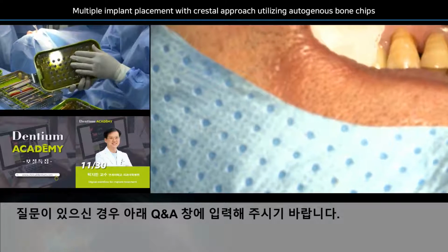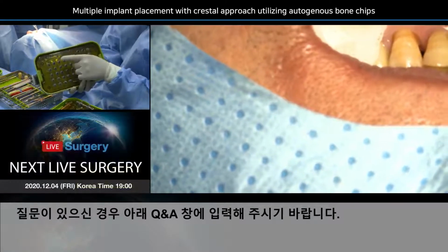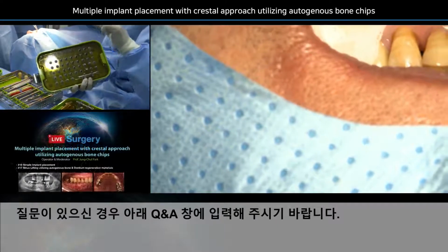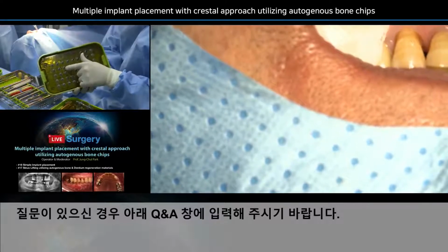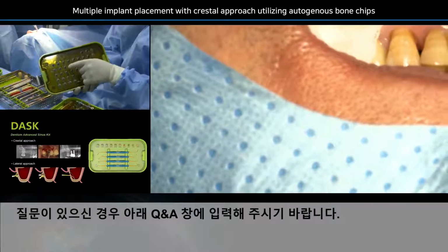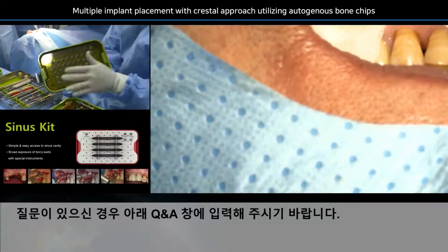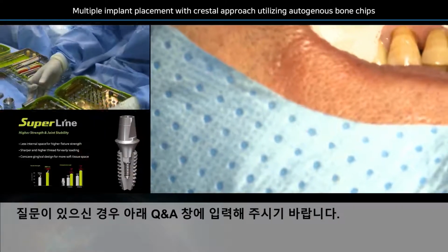If you are still an experienced surgeon, you can still use the stopper. If you choose the 10 millimeter, you can use the 8 millimeter drill. You don't have to go all the way. You just follow 8 millimeter, but still you have 2 millimeter space, so it will eventually prevent the accident. So today I'm going to use both of them to show you how these drills work.